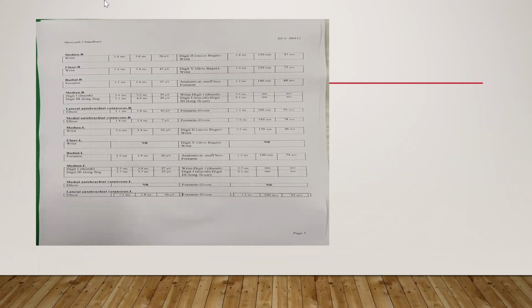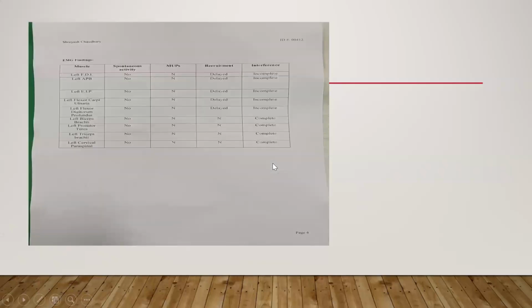Okay, EMG. So the only difference between the medial cord and lower trunk is extensor indicis, or the radial innervated C8T1 muscles. So from this nerve conduction study, the possibility of lower trunk versus medial cord is there. You do the EMG.